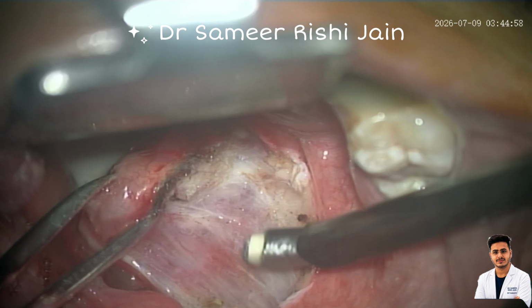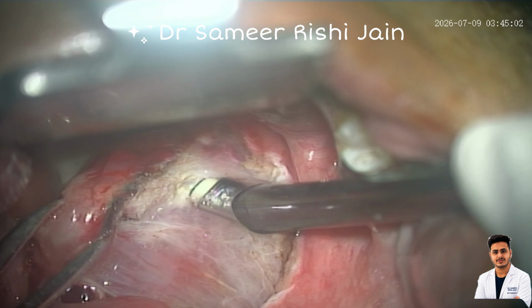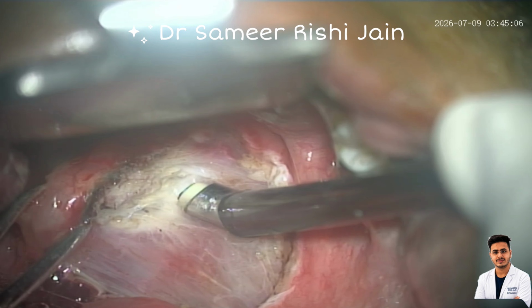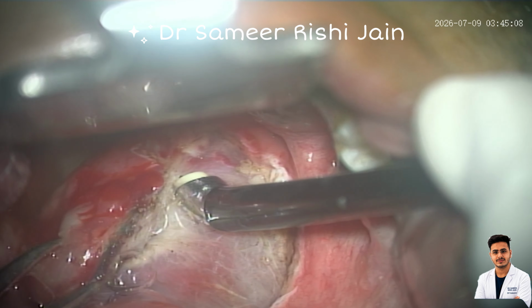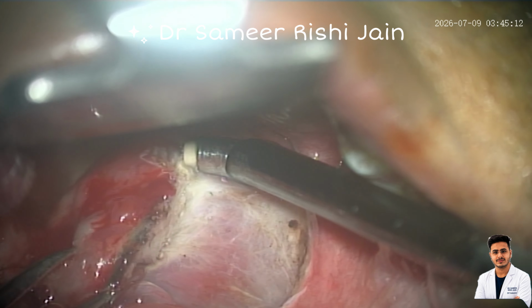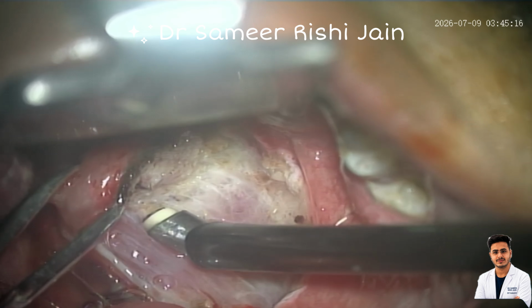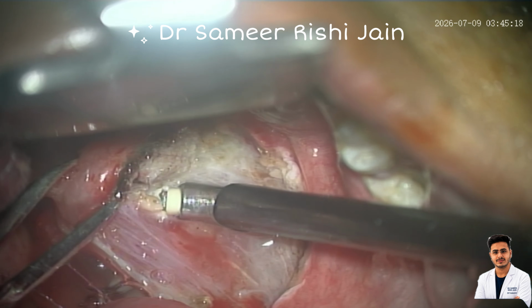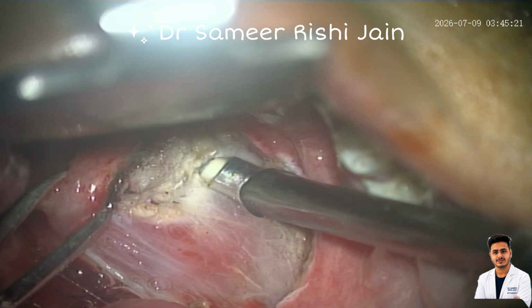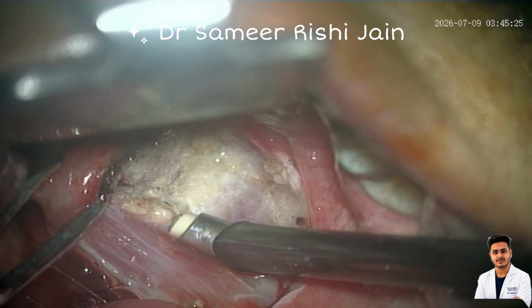We can use the coagulation mode if we see any bleeding. So far, we have encountered a very minimal bleeding. We can clearly see the differentiation between the tonsillar tissue and the fibrous tissue, and I am dividing at the junction of the tonsillar and the fibrous tissue. We can see the cotyledons of the tonsillar tissue coming in our view.